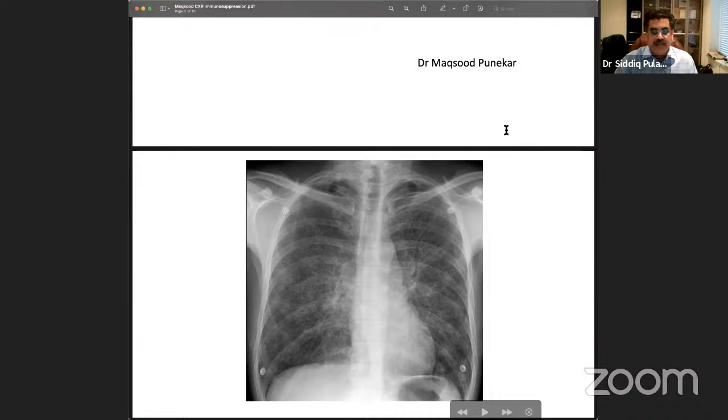And if the clinician has a good suspicion about something going on with the clinical signs, would that lateral view help, especially if there is no CT scan available for whatever reason? Of course. So you can see the images, right? Can you see the images?